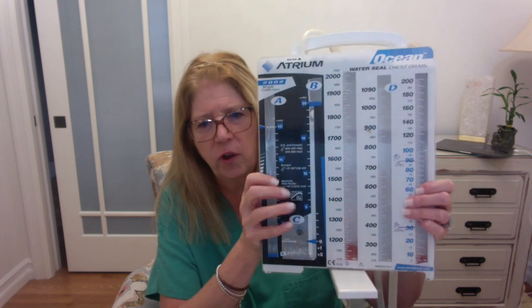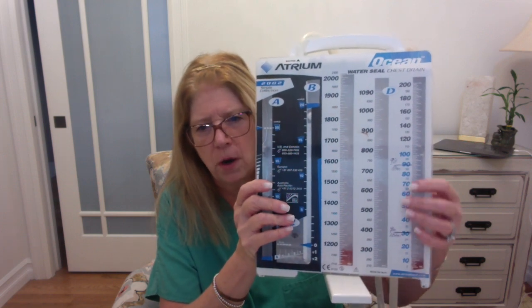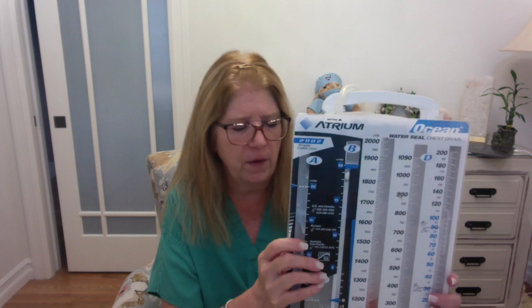You want to assess the site of insertion for bleeding or signs of infection. And of course, you want to assess your drainage, right? What color is the drainage? What is the amount of the drainage? Is there any change to the amount or the color of the drainage? Now, occasionally, a provider might ask for a specimen to be sent.